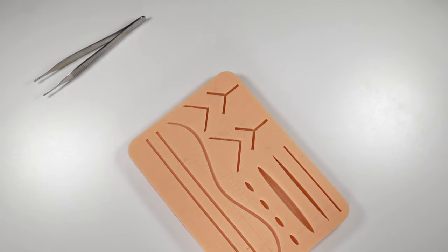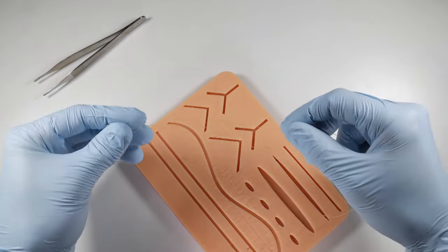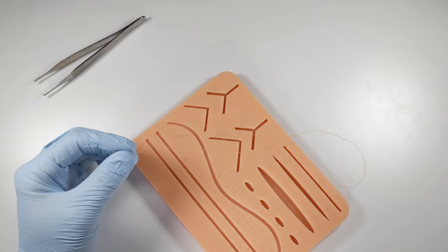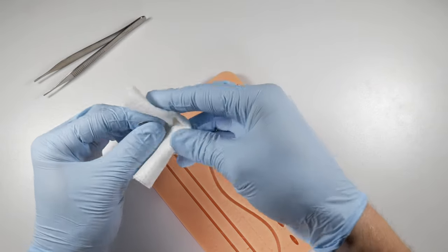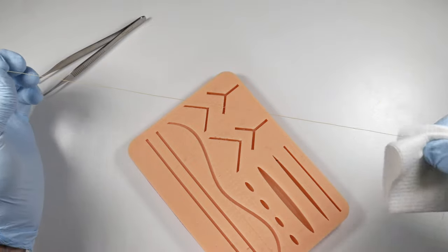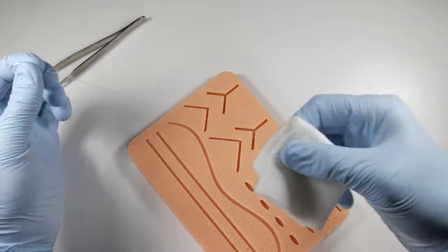When you're working with gut sutures, make sure that when you take it out of the package, you use a wet gauze. Take a gauze that's wet and run it along that suture to pull it tight and get some of the kinks out of there.